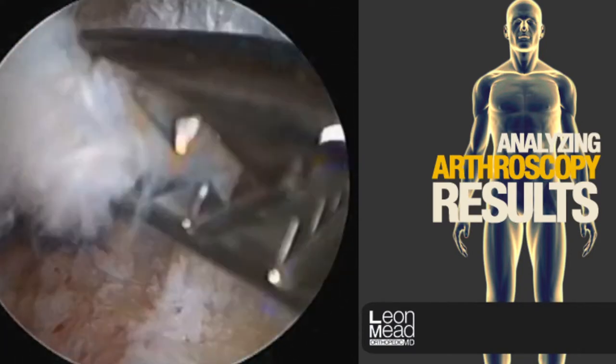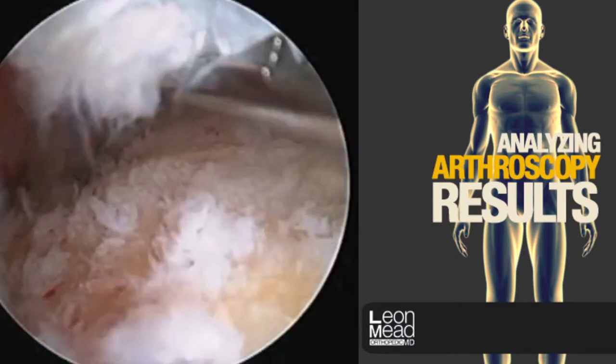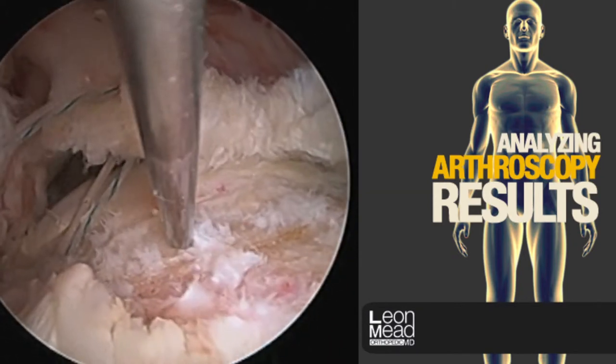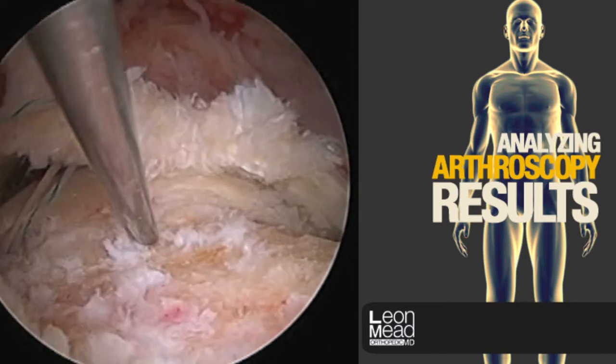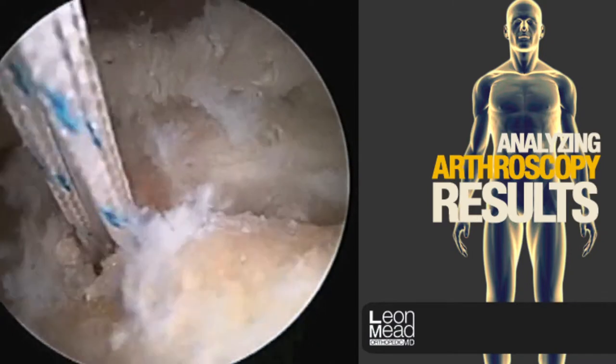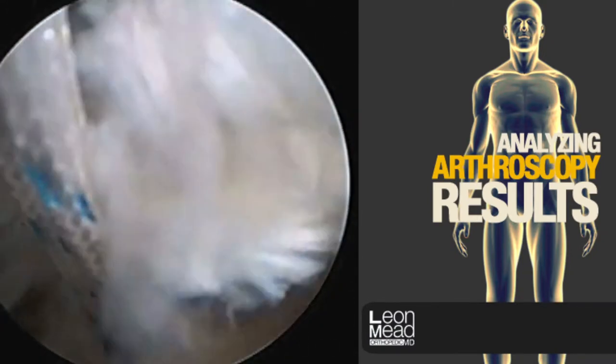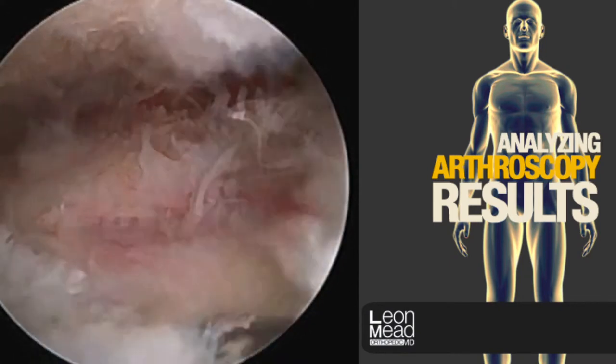Again grabbing the edge of the cuff to determine its excursion, we can also get a good feel for how much tension is on it. We use a needle to help localize where we want our anchors to go — we do this through the skin — while grasping the rotator cuff tissue.